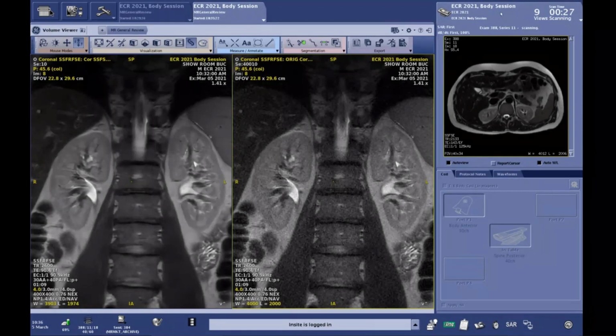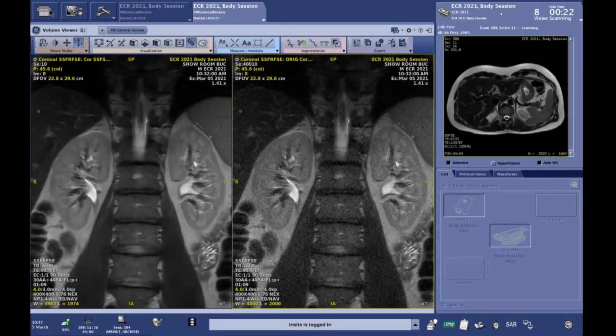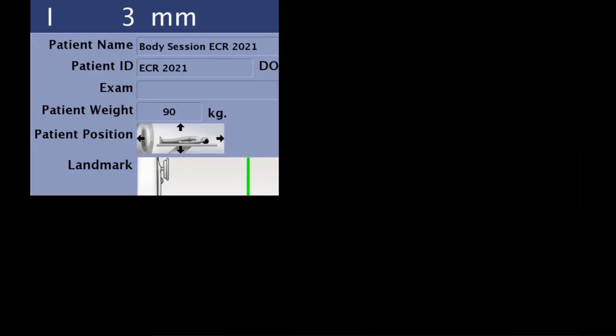I wanted to say something about deep learning reconstruction. I had an interesting discussion yesterday, comparing deep learning reconstruction with a DSLR camera, the reflex camera, Canon, Nikon, whatever. The beauty of AIR Recon DL is that it works on raw data, which is why you have the maximum potential for improving your image quality and getting rid of some of the truncation artifact.